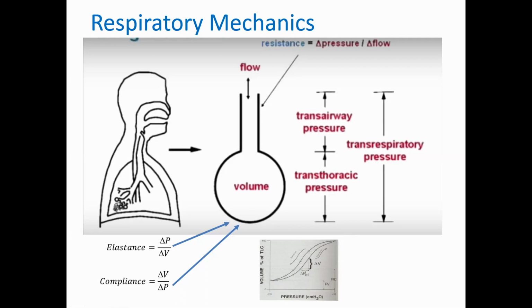So, the graph for the airway resistance. Sorry guys, you're not here, you're not going to see my Picasso. When you're plotting airway resistance against volume, it's something like that. And at FRC, it's at its best. At FRC, sorry, it's the lowest resistance. Good.